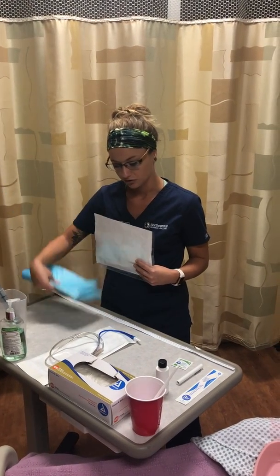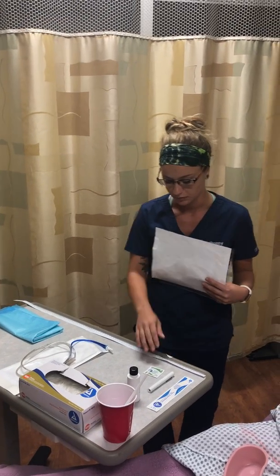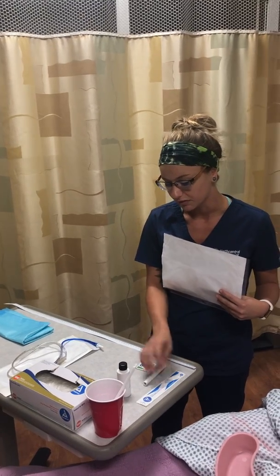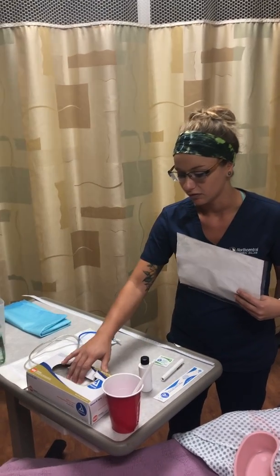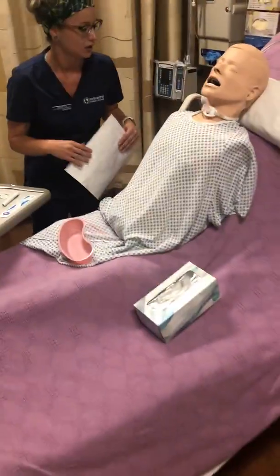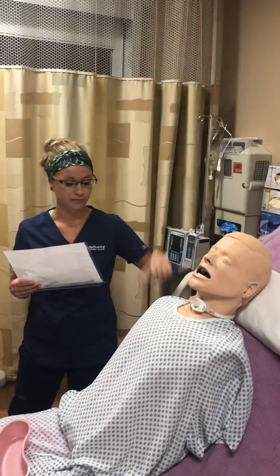I have a towel or Chuck's pad, measuring tape, some tape, a prep pad, a pen light or flashlight, tongue depressor, some lubricant, some gloves, maybe some water if my patient isn't NPO and is able to swallow. Maybe an emesis basin, some tissues, and I have already checked my suction beforehand to make sure it's working properly.